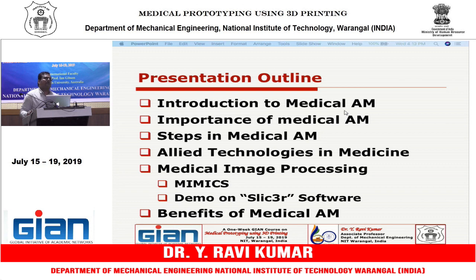So definitely you must have some 3D scanning system to capture the surface or to digitize your dentures into a CAD model. Once you get a CAD model, you can use it for either implantation or template or device. So you can use it once you convert that physical denture into a CAD model or a computer model or soft data.